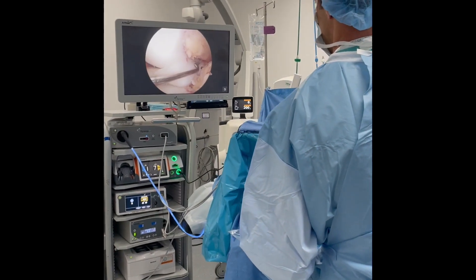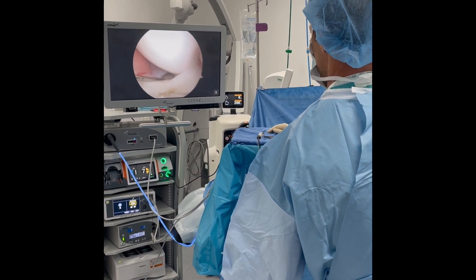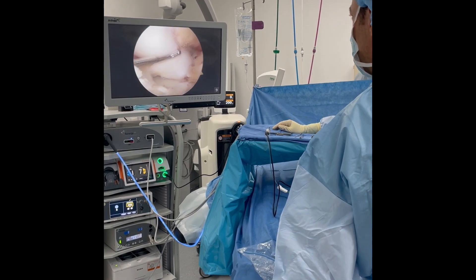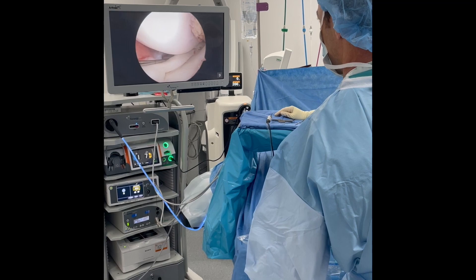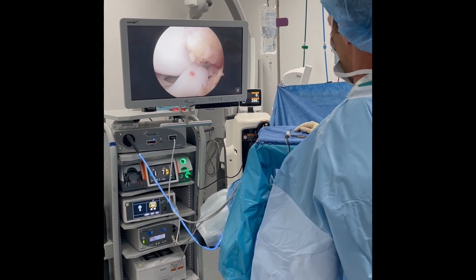This is her medial meniscus bucketed forward. There's the remnant that we're going to sew back to back here and redirect it back in position. Without saving the meniscus, it could be really easy — you just trim it here, cut this, and then cut it right here.